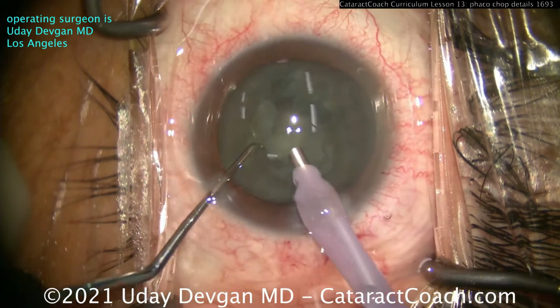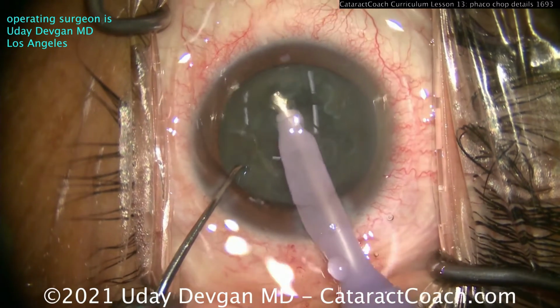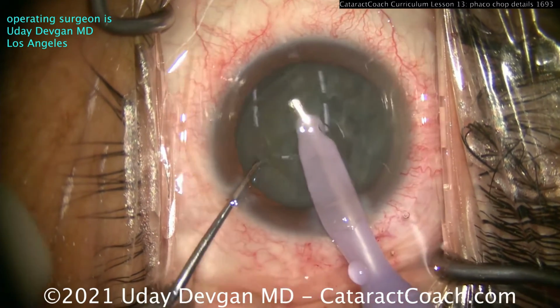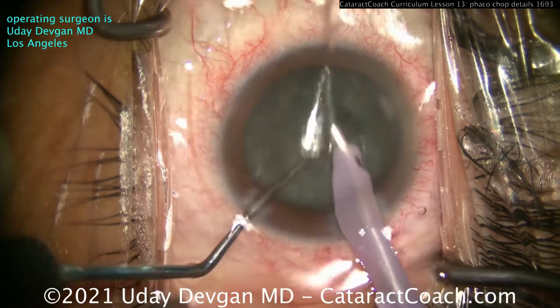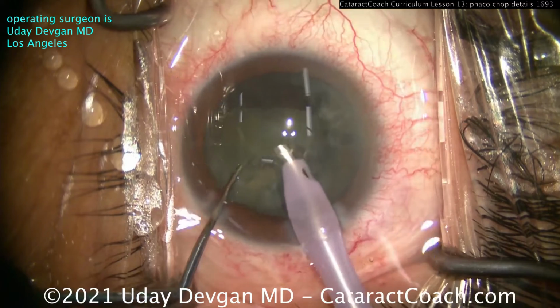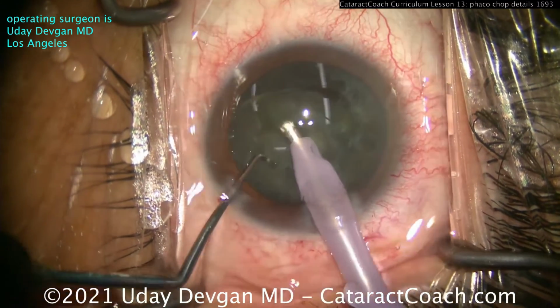I need to get the nucleus out of the capsular bag. Primarily vacuum. Don't give energy here. Control that foot. Just vacuum on the pedal. And see how we're rotating the nucleus and trying to bring it in. Still didn't get it. A little bit better. There's a little bit of a break. Trying to get the instruments around that. Try again. Finally.